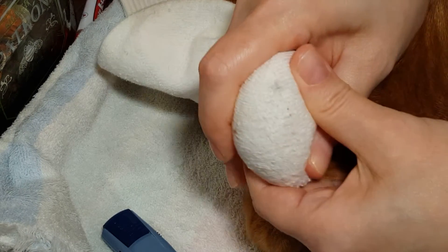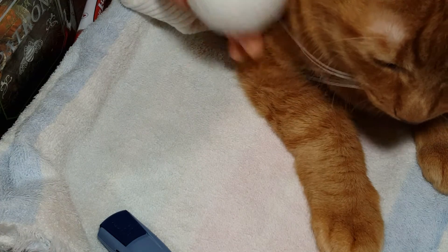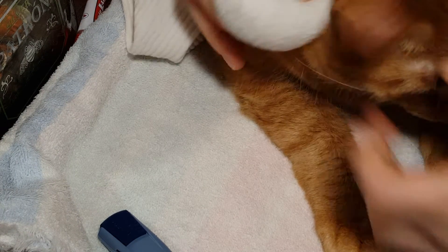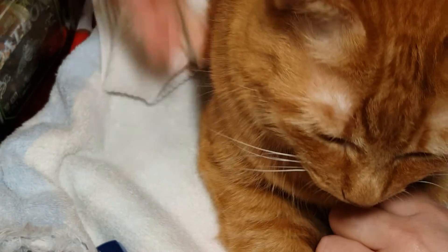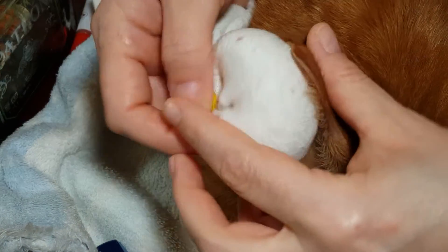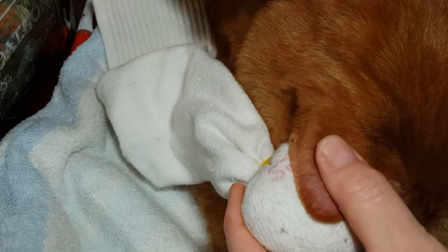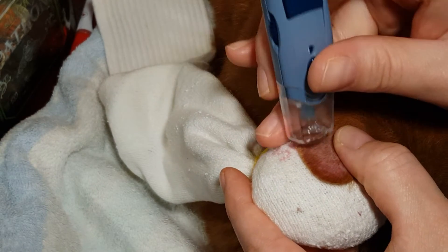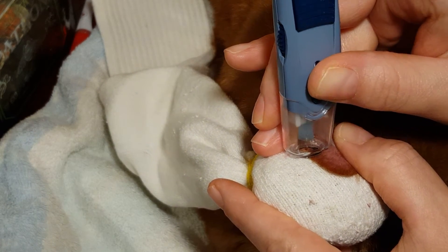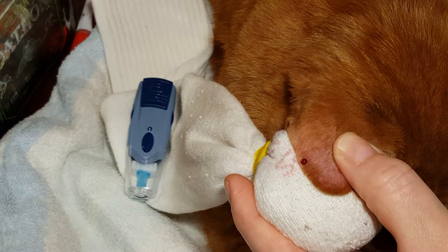Peanut's very used to this. Okay, when you're ready, stick the sock under the ear and then position the lancet right on the edge, and then poke. That easy.